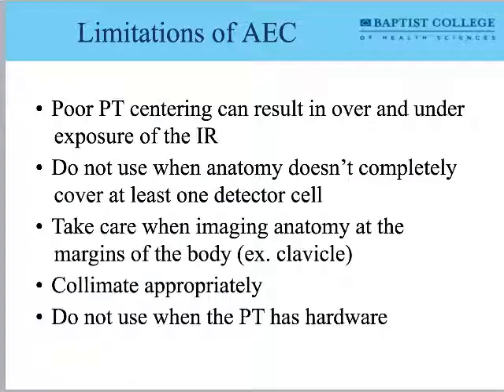Be careful when you're using this, especially for pediatric patients, or when you're doing stuff up towards the margin of the body, like with a clavicle. We're about to look at that in procedures. Probably don't want to use an AEC for imaging of the clavicle.